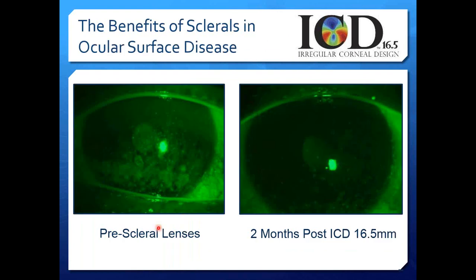And in ocular surface disease, they're being used more with greater frequency. And here's an example where we had a patient that came in severe pain. With each blink, it was like needles to the eye. And after 2 months in the ICD, you can see the recovery of the corneal surface. But what you can't see in these images is how this patient was able to walk in under their own direction without bringing somebody to walk them through the door.